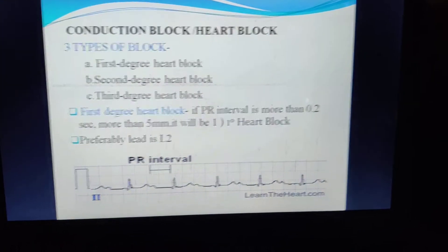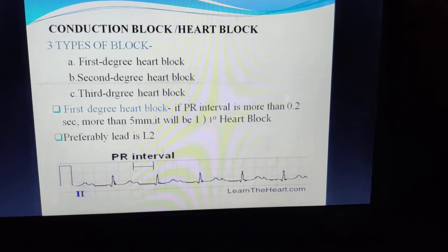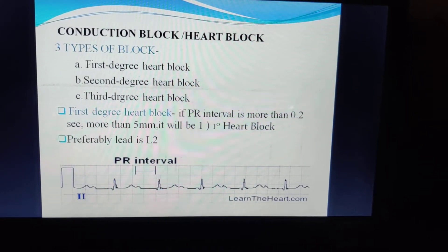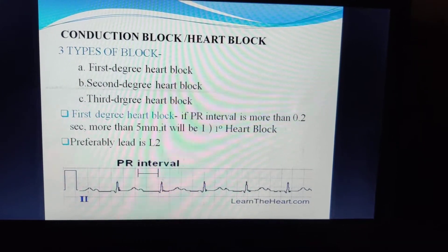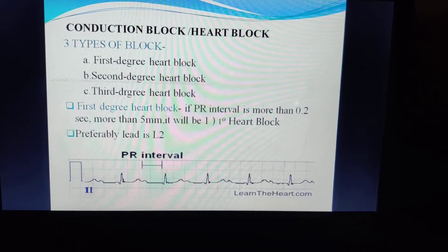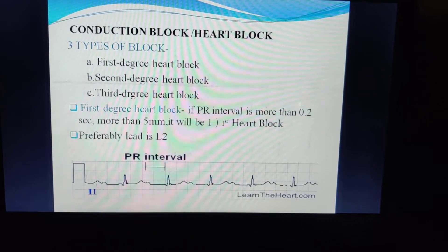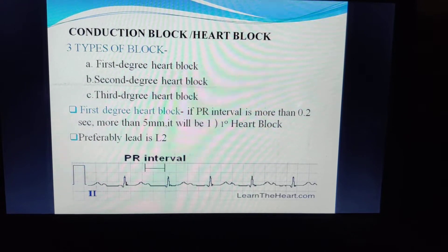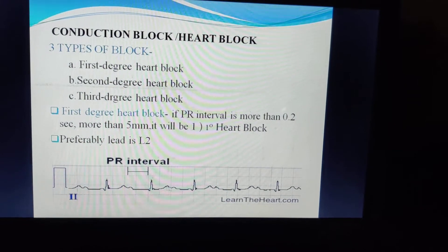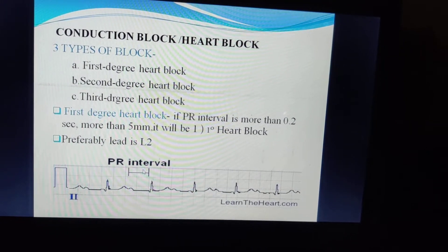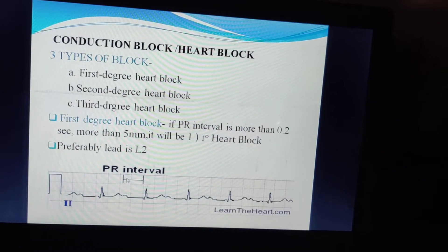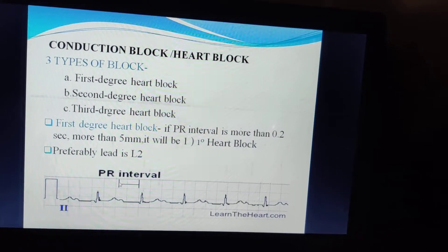Conduction block, also known as heart block or atrioventricular block, is of three types: first degree, second degree, and third degree heart block. In first degree heart block, the PR interval is more than 0.2 seconds or covers more than one large square (more than 5 small squares). To assess this, we preferably look at lead L2. A PR interval covering more than one large square is classified as first degree heart block.